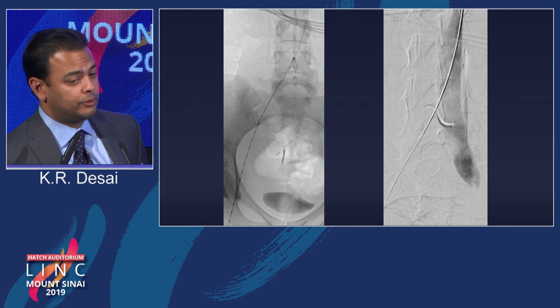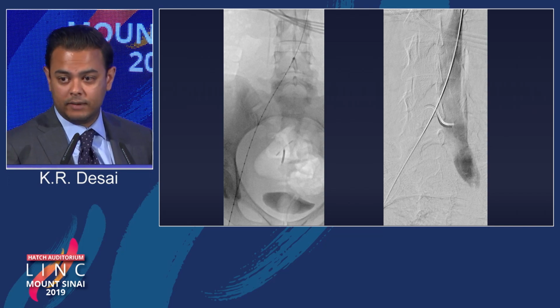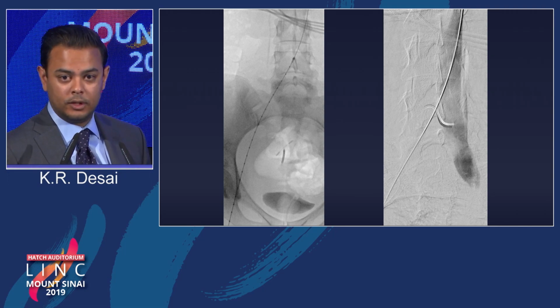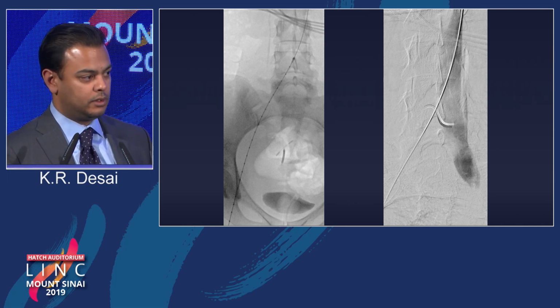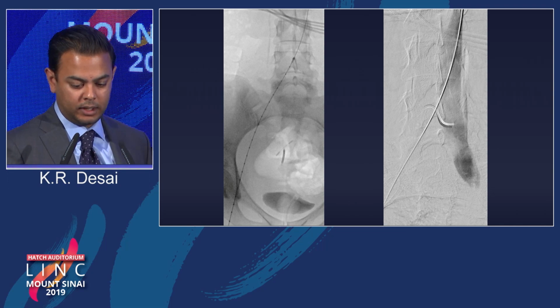One thing I like to do before I place my stent is map out exactly where my stent is going to be. Certainly IVUS is very helpful for this, but I actually just like to use a reverse curve catheter, an old-fashioned technique. Center, so that you have no parallax in your imaging plane. I do a simultaneous injection from my sheath as well as my reverse curve catheter. It shows your anatomy beautifully. It's in the center of your field. I lock the table there, and then I pick my stent.